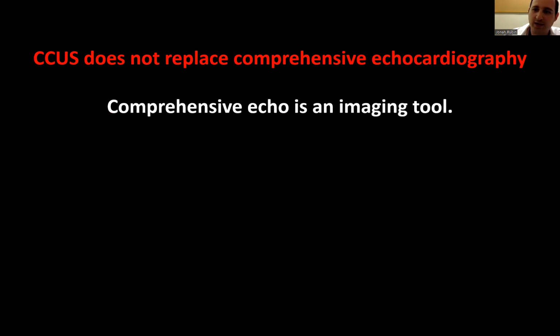Obviously, if you ever think that a patient needs a comprehensive echo, then you should still be getting a comprehensive echo, and you should never take your critical care focus to obviate the need for getting a comprehensive echo. But the way I think about this, and I think others have agreed or have not protested too strongly, is that comprehensive echo to me is an imaging tool. I think of it as like getting an MRI, but it's a good imaging tool for your heart. If you need to take a really good look at the aortic valve and quantify the specific gradient in the aortic valve area, you're much better off. You need a comprehensive echo.